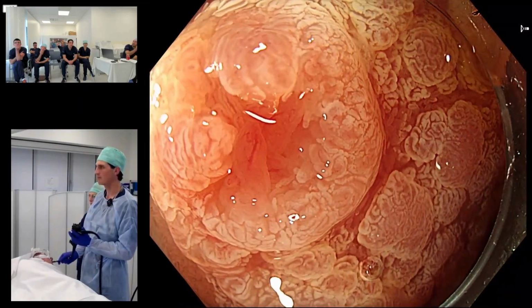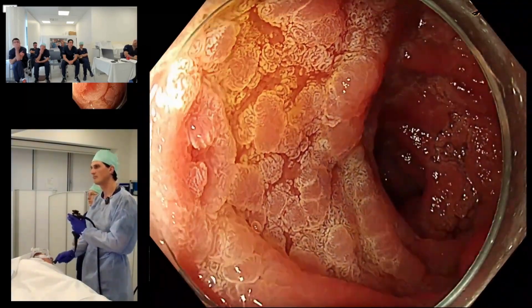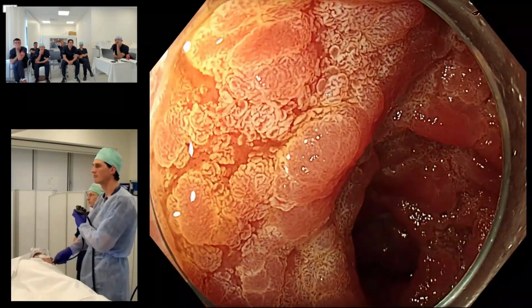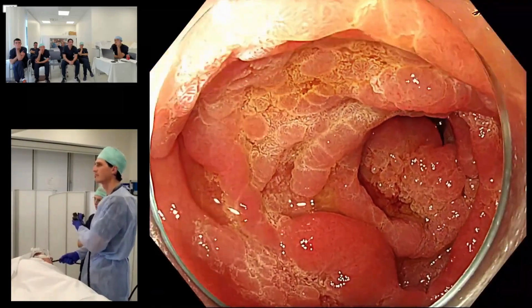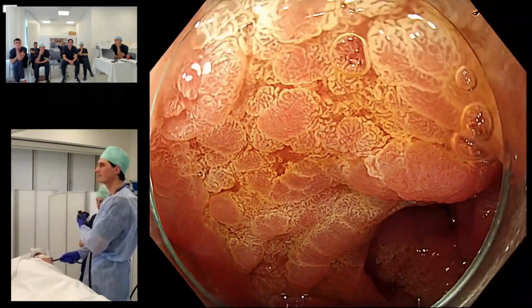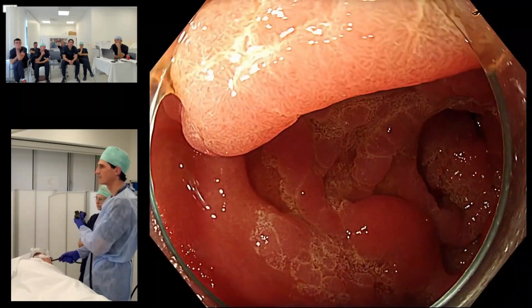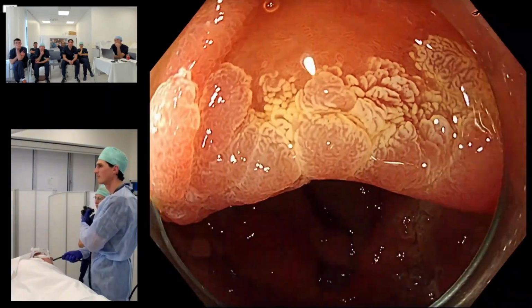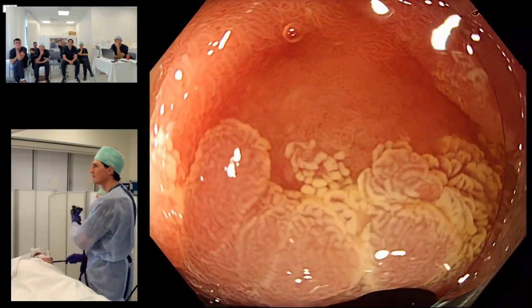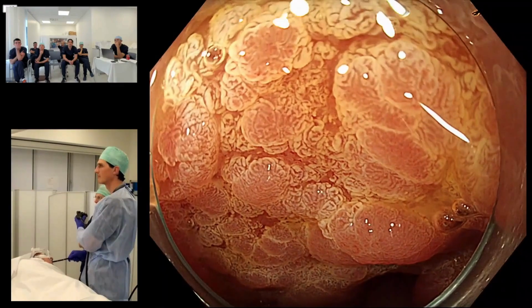And just come back and, I mean, nice imaging. Come back and see if you can see the minor papilla. So if people don't know where the minor papilla is, for you, where would the minor papilla be? Now, if this is in the 10 o'clock position, which it now is, or 11 o'clock, where should the minor papilla be? 12 maybe, at 12 and back, right? So we just saw it cranially. I think I just saw it just beyond that fold there. Let's flick back again. Tip up. So just on the tip left.